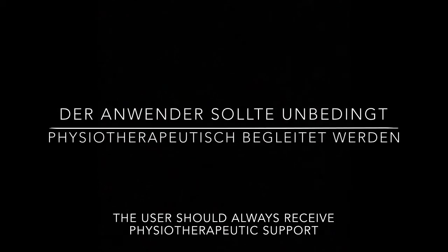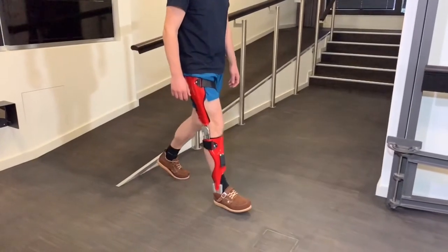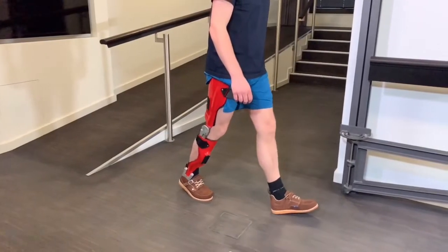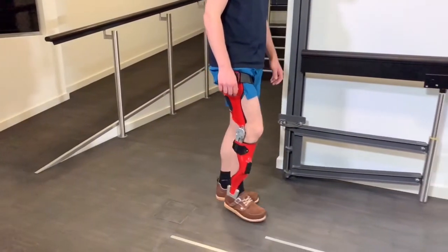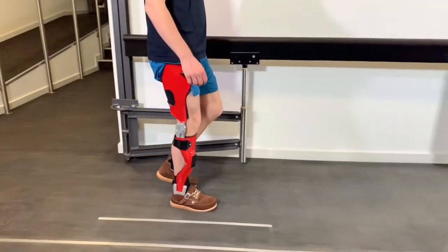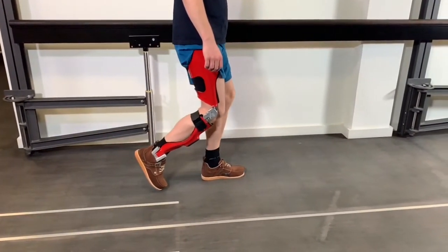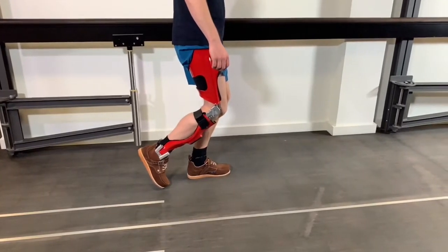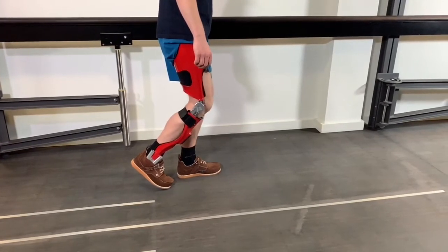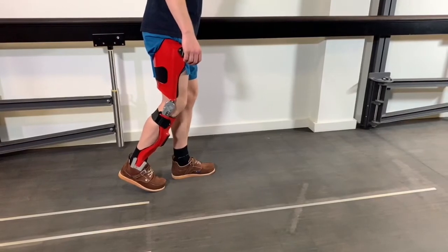The user should always have supervised physical therapy and receive a detailed introduction to the product and its functions. Because the Neurotronic recognizes the end of the swing phase when the forward movement of the leg slows, the system will also recognize if the user should stumble — that is, if the leg gets stuck on the floor during the swing phase. In such a case, the user will be reliably secured by the locking of the knee joint. The person can extend the leg, take a deep breath, and continue walking.